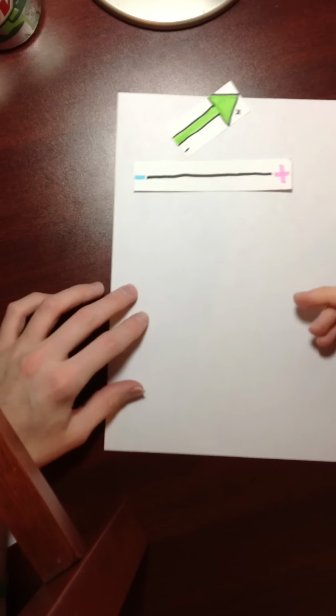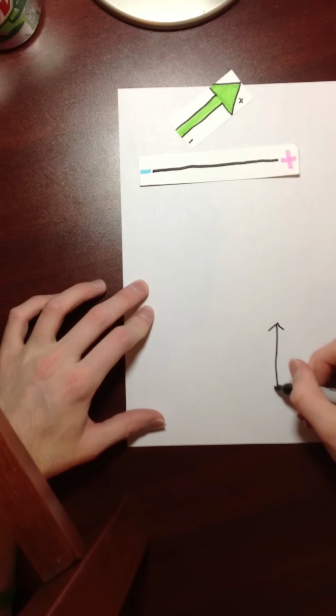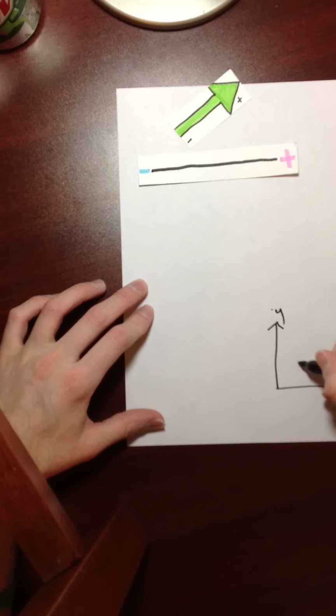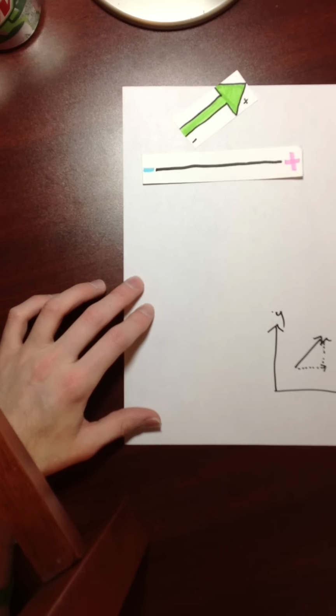Well, if you remember from physics, if I plot a vector on a graph, this is x and y here, right? And this is a vector here. Well, one thing that we could do is separate this into two individual components.